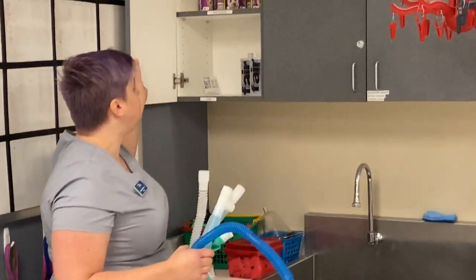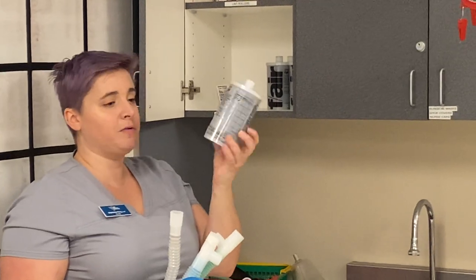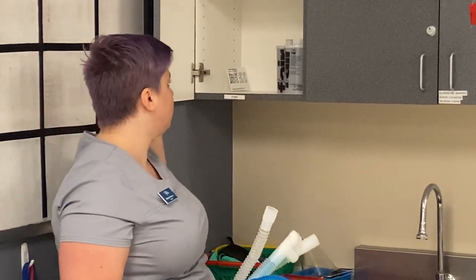The last thing I want to show you is that if you need it, there are brand new efar canisters right here. If the one on your machine is over 50 grams from the start of use, you'll go ahead and grab one of those.